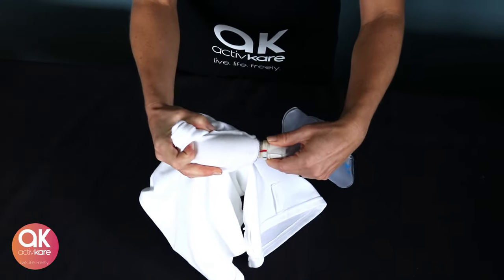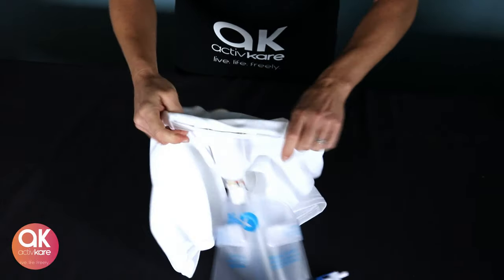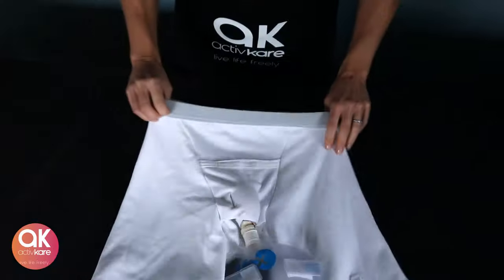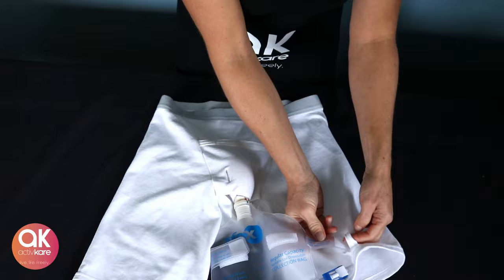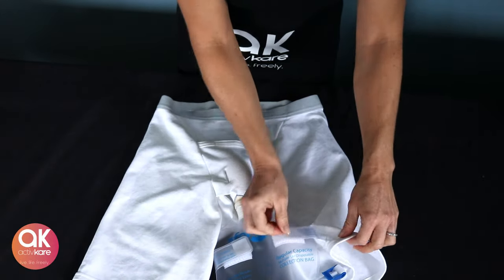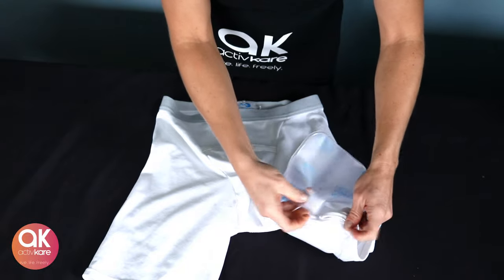Connect orange to orange, then turn to blue and black alignment. Use the safety velcro tabs to hold the bag in place for additional discreetness. The bag is now securely attached to the brief and lays discreetly on the inner left thigh.